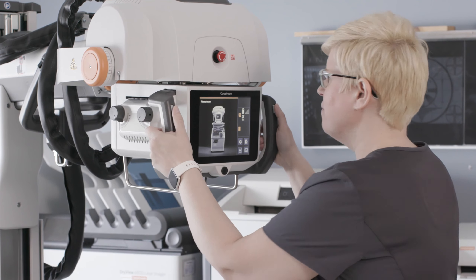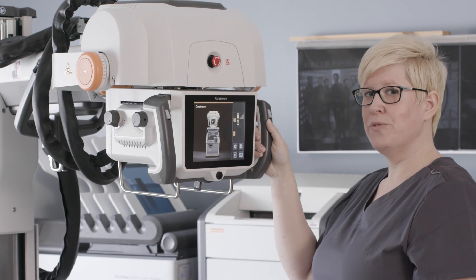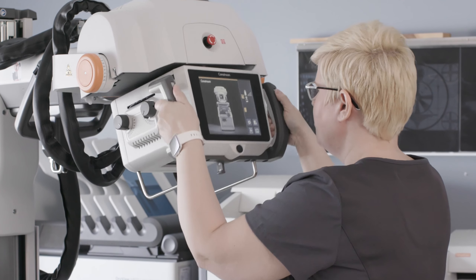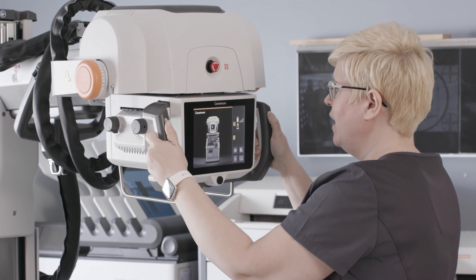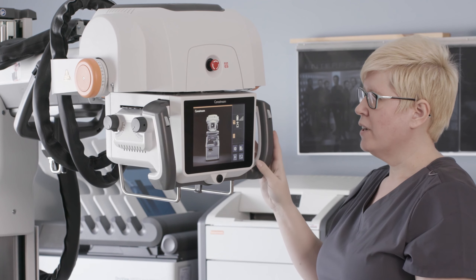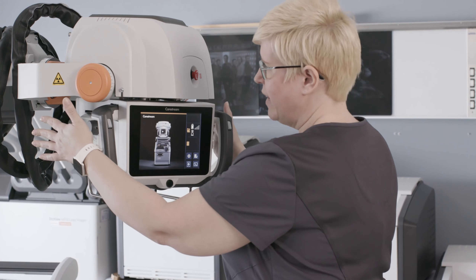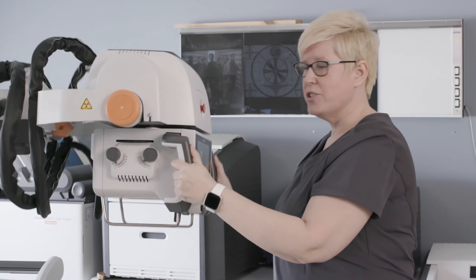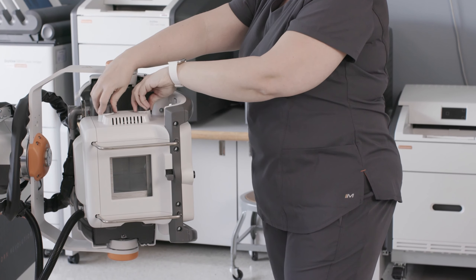The tube head on the DRX Revolution mobile system has been redesigned. The overall weight and size has been reduced, making this much easier to maneuver in tight situations, such as a patient incubator in the neonatal intensive care unit. We've also increased the range of motion, specifically in the back and forth motion of the tube, and we've added detents to allow the technologist to have some tactile feedback when positioning the tube for their exam. The collimator knobs, which are traditionally on the front of the tube, have been redesigned and are now on both sides of the tube head, giving the technologist access to the collimator controls regardless of their position — for example, in a cross table lateral situation.